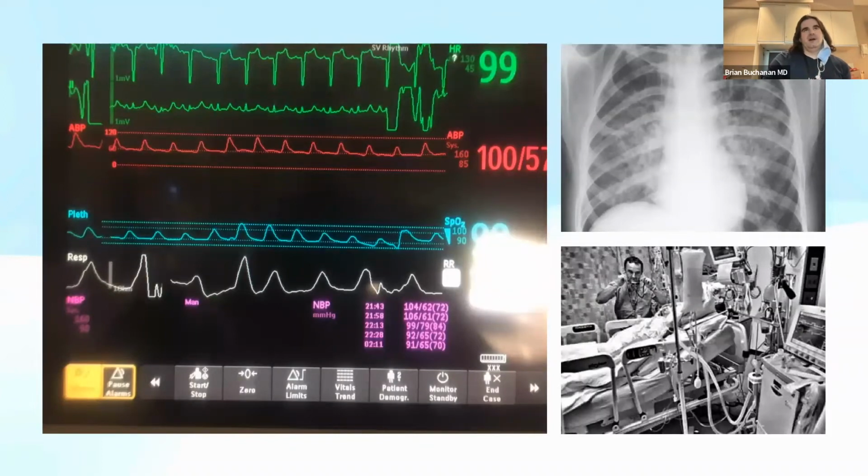Of course, echo allows you to help differentiate shock, troubleshoot hemodynamics, look at things like volume status, for example, or even whether pressors and inotropes can be harming a patient, right? Where, say, you have dynamic outflow tract obstruction. Or in troubleshooting respiratory failure, right? Whether it's pulmonary edema, for example, or just simple pneumonia with a normal functioning heart.